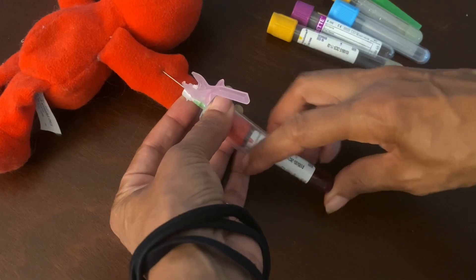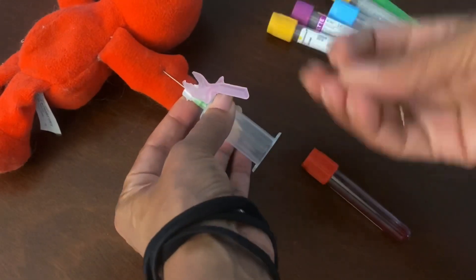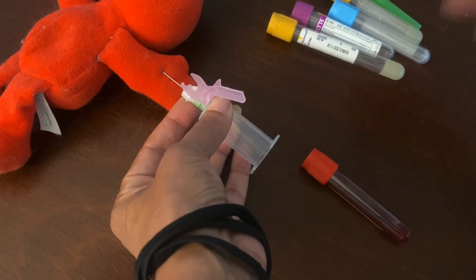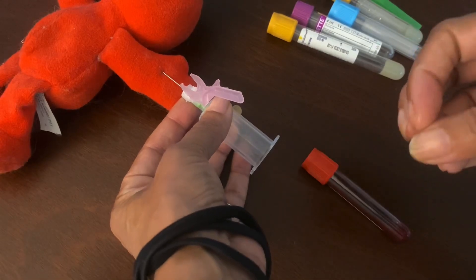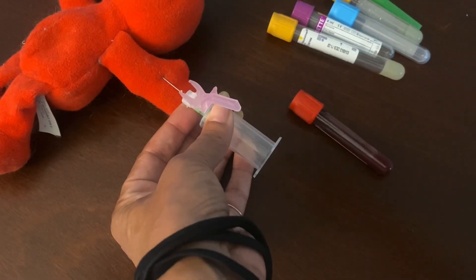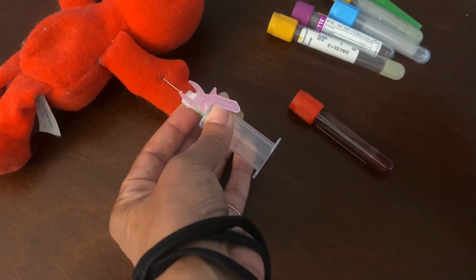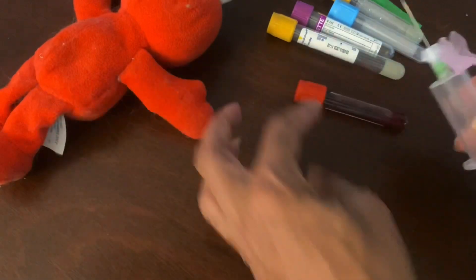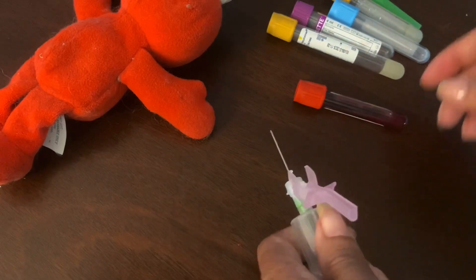Some people say when I put the tube in and pull it out, I move the needle. That's because you don't have control — that's because you've not switched hands and made it comfortable for you. You have to make this comfortable for you, especially when you get into the field, especially when you get out into the real world. The deep veins — you got that. You know how to switch. I teach switching because it's all about comfort for you. If you're not comfortable, you're going to injure yourself and possibly injure your patient. If you're moving around and the needle could slip out, you could slip out — now you've got blood going everywhere, now you're nervous. Make it comfortable for you.